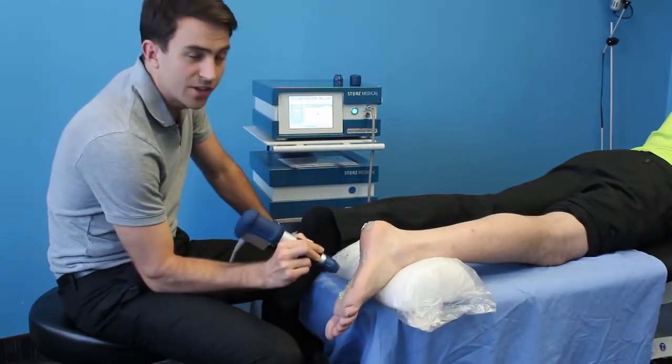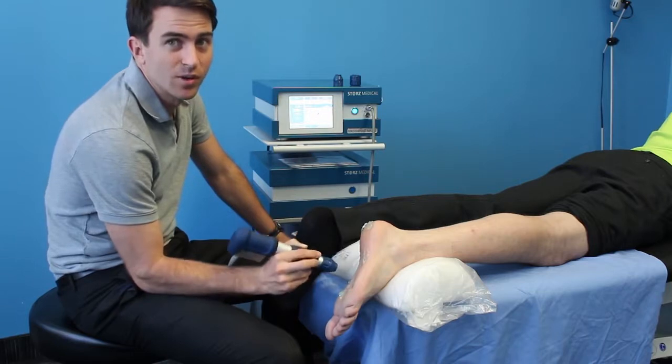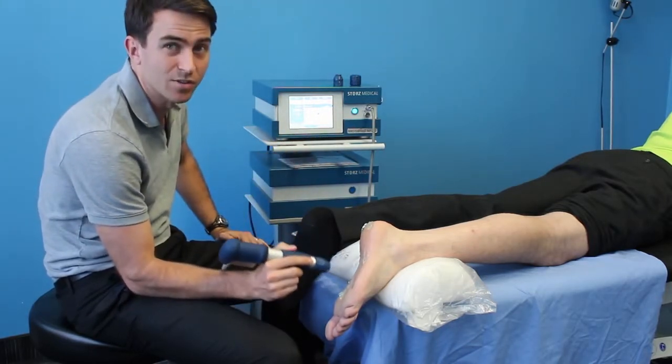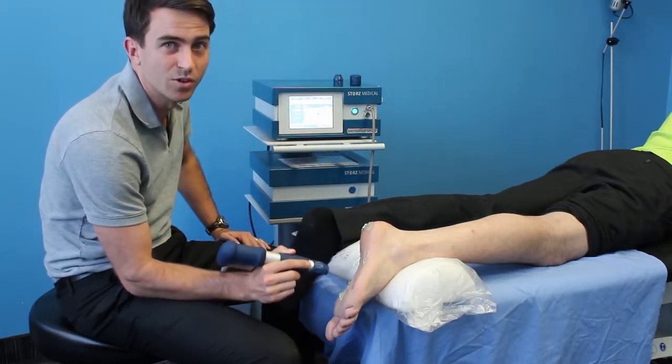Some clinics tend to only treat the actual area of pain, or they only treat with a certain amount of shocks per area. Here at Ace Physio, we like to think that the whole body is connected, so we treat not just the areas that are affected by the pain, but the areas around it, because we believe that those areas are having a negative impact on your pain.